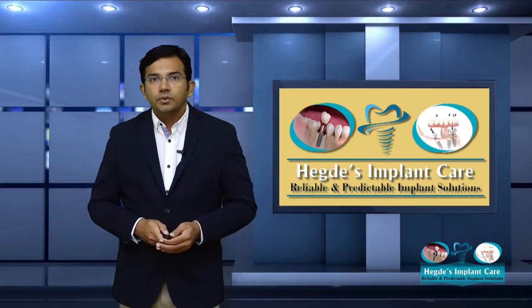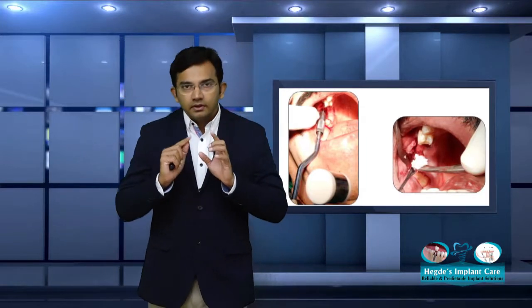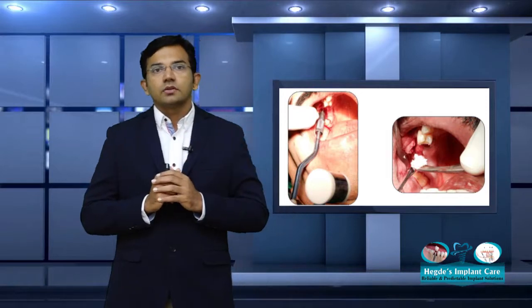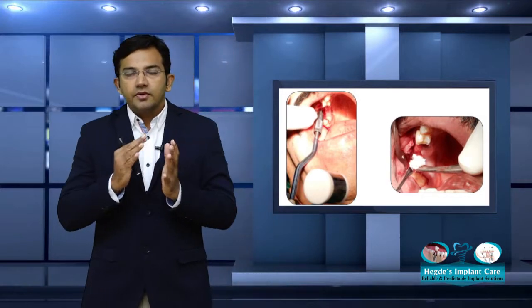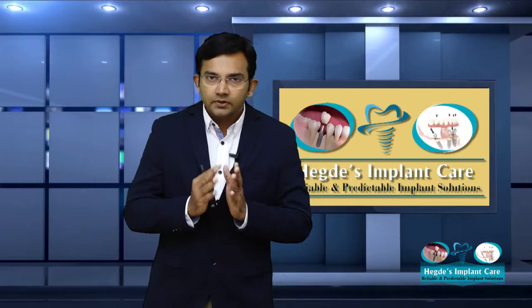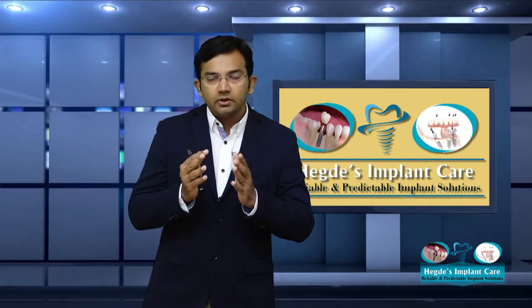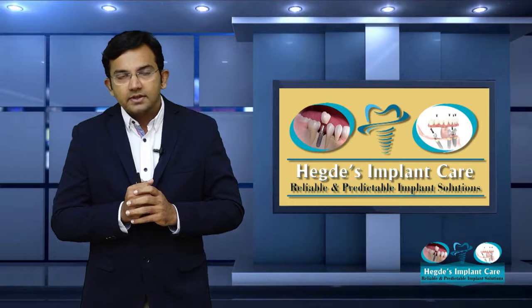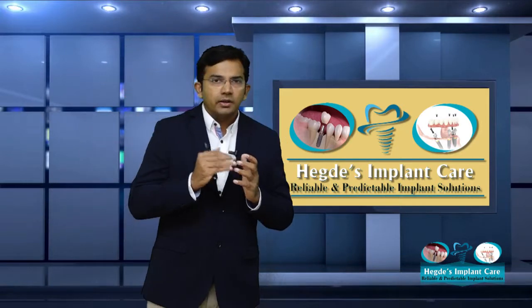You can see the picture, how we go about it. I have done the osteotomy using my surgical drill. I have gone near the sinus, just about 1 mm short of it. I have used the osteotome, slightly tapped it, and lifted the sinus. We have different sizes of osteotomes, so sequentially I have enlarged the size of the osteotomy, and also slightly lifted the maxillary sinus. I have done a lift of about 4 mm here.